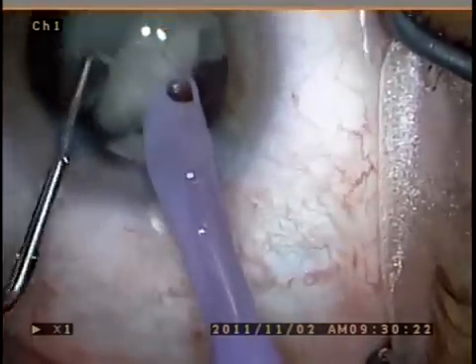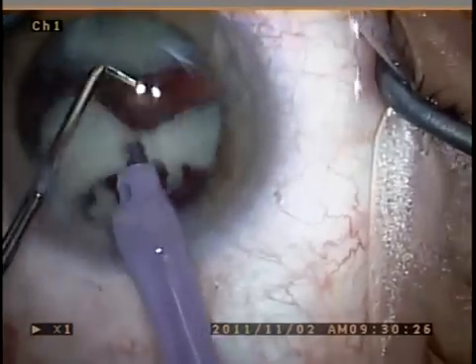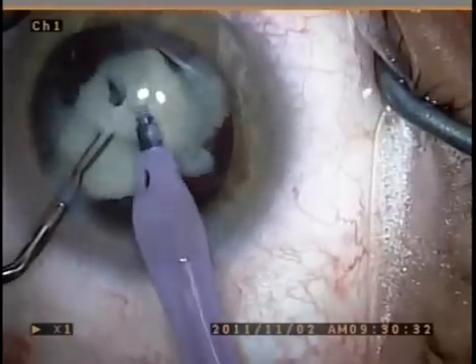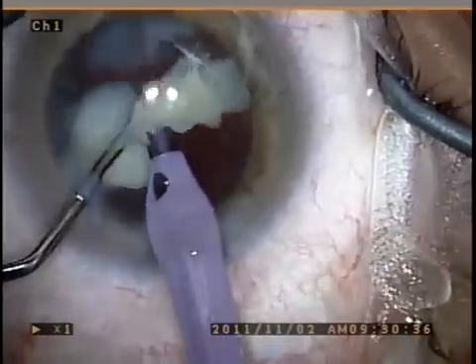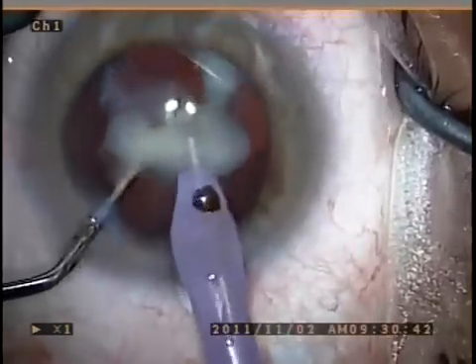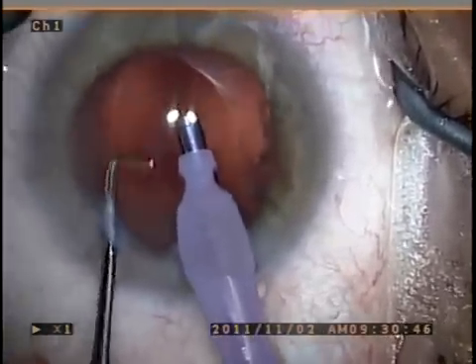At this point I'm also very aware of the fact that I have no protection of the posterior capsule, since all the epinuclear material is already liquefied and gone. So I do use the second instrument as a barrier for the posterior capsule to keep it from bounding up into my phaco tip with any surges that may occur.